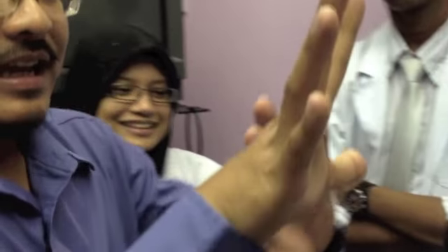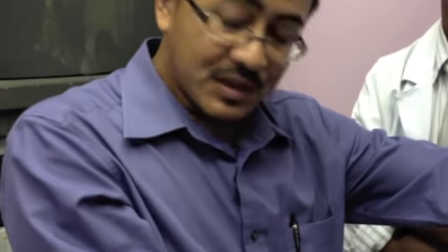38C, 38C. 78A. 85B. Okay, alright. So you say it 5 times. If possible, even more than 3 times is okay. If 5 times, that's good. But you have to check your conversation level. Then you know where the level is, and if they can't hear conversation, only can hear whisper, that means you know the decibel is just about this area.